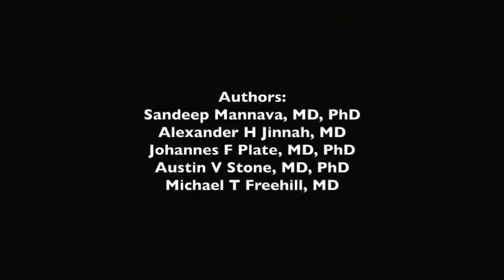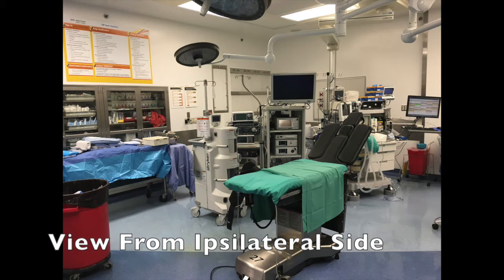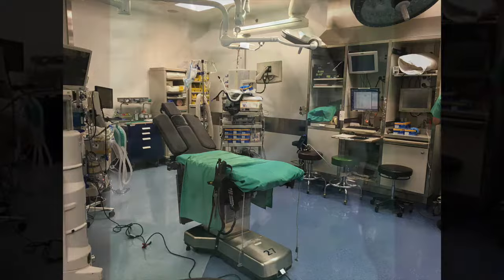Shoulder Arthroscopy: Beach Chair Position and Patient Preparation. Basic operating room setup consists of the surgeon and assistance along with the back instrument table located on the operative side. The arthroscopic equipment is located on the contralateral side. At our institution, a standard Steris AMSCO surgical ortho-vision operating table is used.